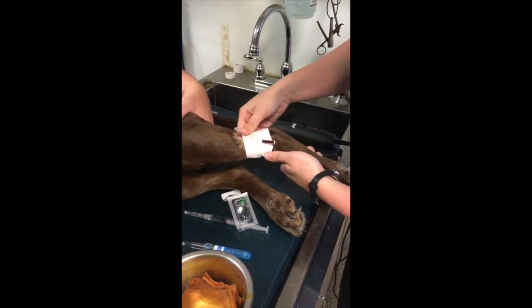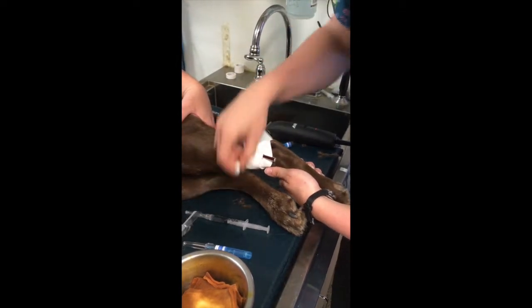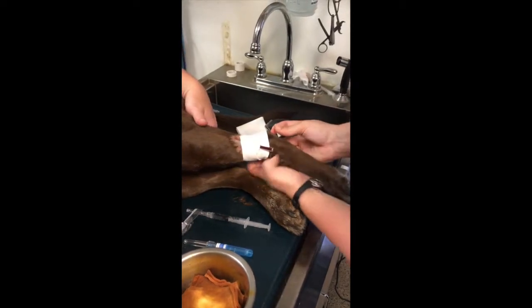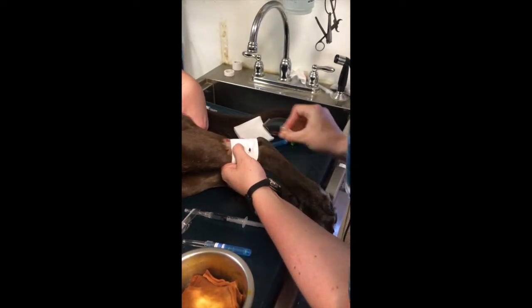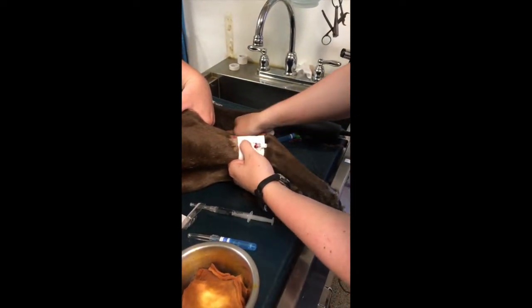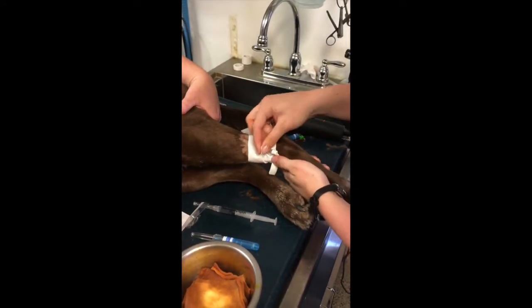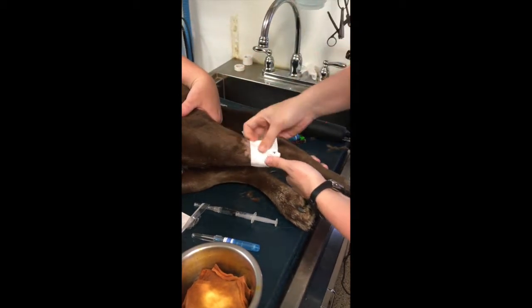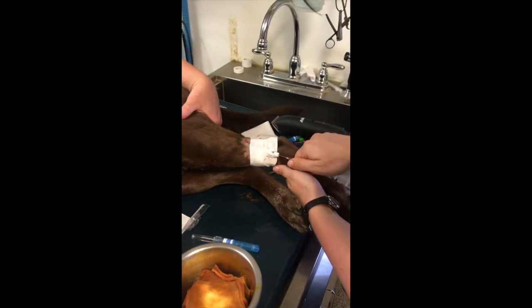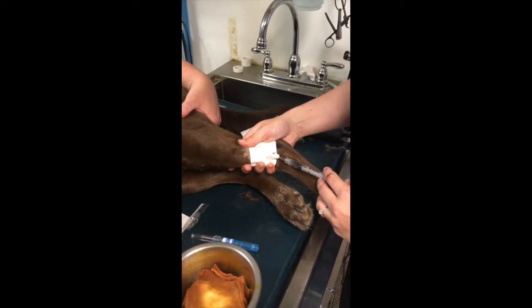And when placing a lateral saphenous catheter, you want to make sure your catheter runs with the vein. So now that I have that secured, I'm going to go ahead and take my port, my injection cap. I'm going to replace the cap, put it on the catheter. All right, so now that's there. I'm going to go ahead and secure that. Now that I have that secured, I'm going to take my saline flush, and I am going to flush the catheter to make sure that it's patent. And it is.